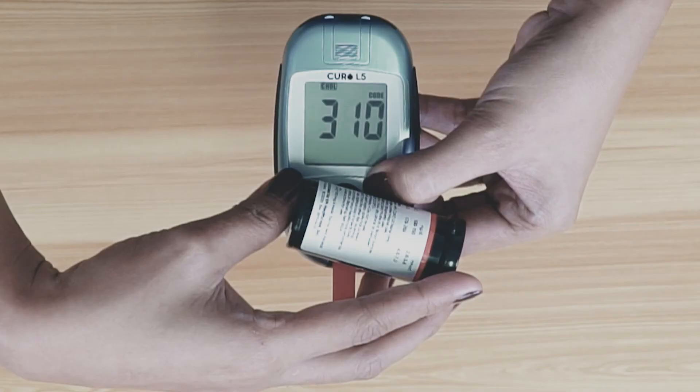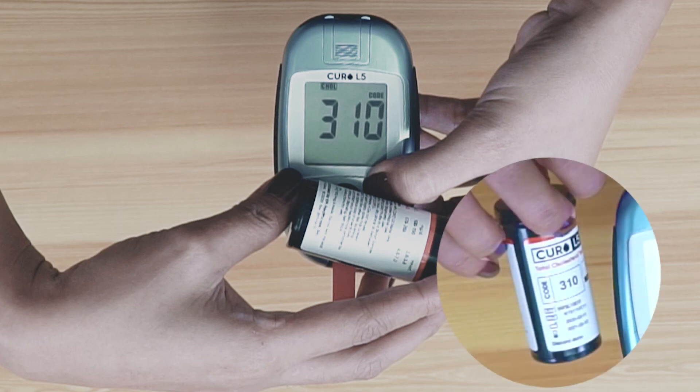Once the device recognizes the RFID, the code value will be displayed on the screen for 2 seconds and should match the code number on the vial.